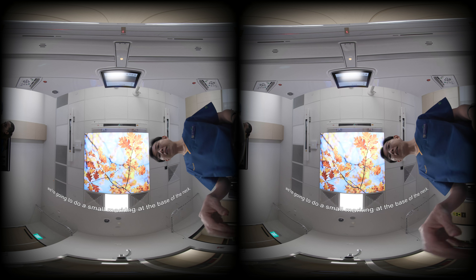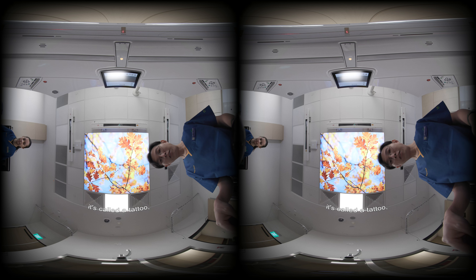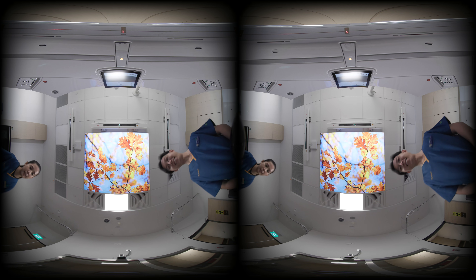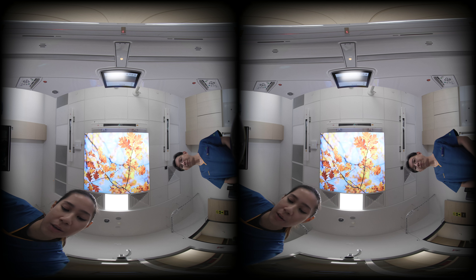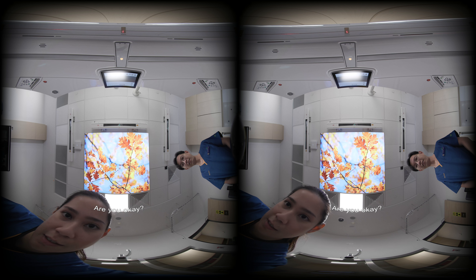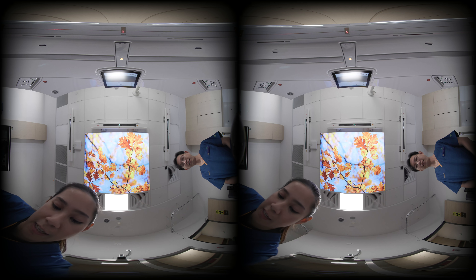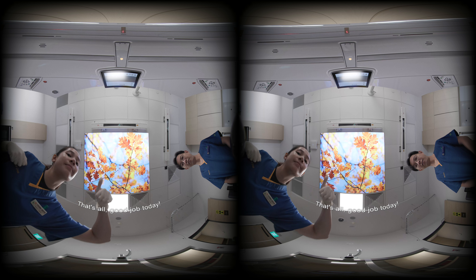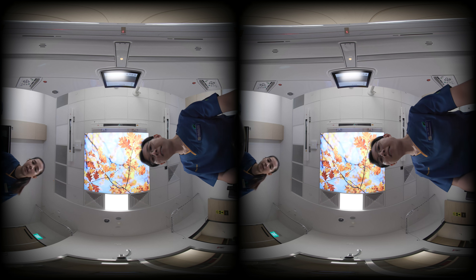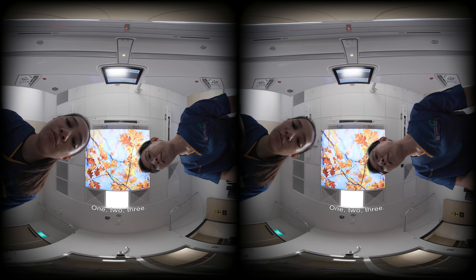The last step: we're going to do a small marking at the base of the neck. It's called a tattoo. You'll feel a little bit like an ant bite. One, two, three. You okay? Yeah, very good. That's all. Good job today. We're going to help you sit up. One, two, three.